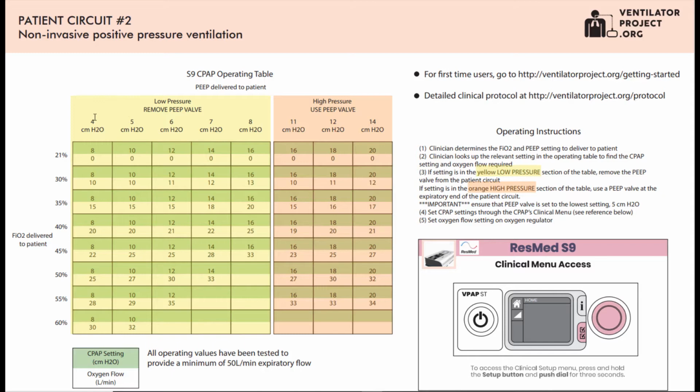The way this operating table works, at the top here are the pressures that you want to deliver to the patient. That's different than the pressure you put on the CPAP. There is pressure loss going through the tube, and there's pressure loss as air is flowing out of the viral filter here. So I go and look and I see what I set on my CPAP to ensure I get 5 centimeters water pressure in the helmet that the patient receives.